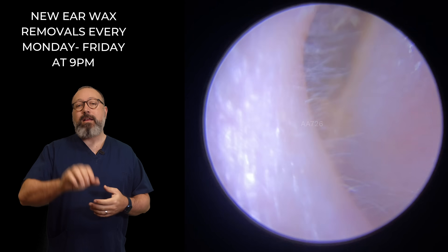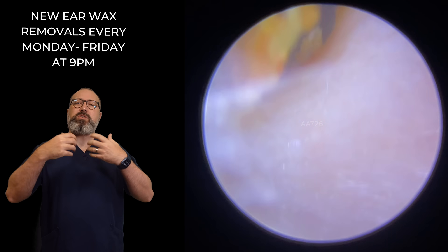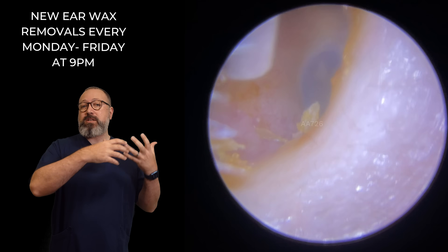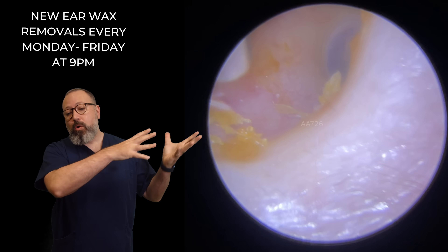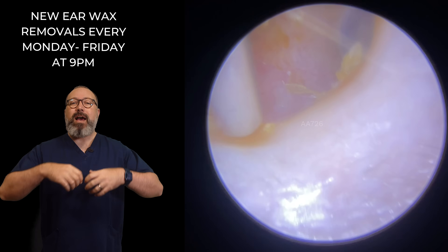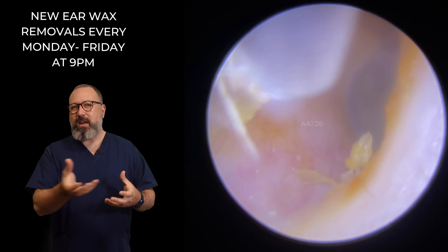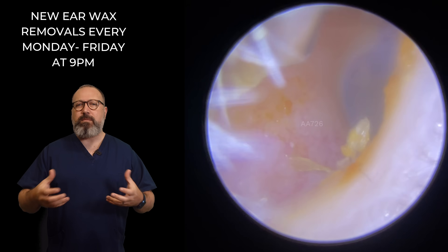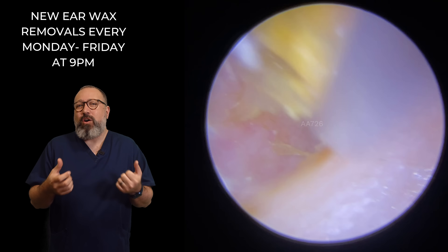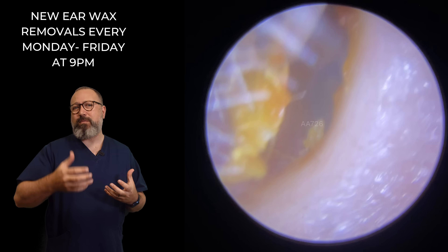This plug is in the lateral portion of the ear canal — it's a quite dry plug of wax. It's common to get drier wax in the lateral portion because the wax has migrated from the deeper medial portion all the way out. As it travels, it should pick up a little oil produced by cells on the outer ear canal, which softens the skin and wax. But as we get older, we don't produce as much of that oil and the wax tends to dry out.